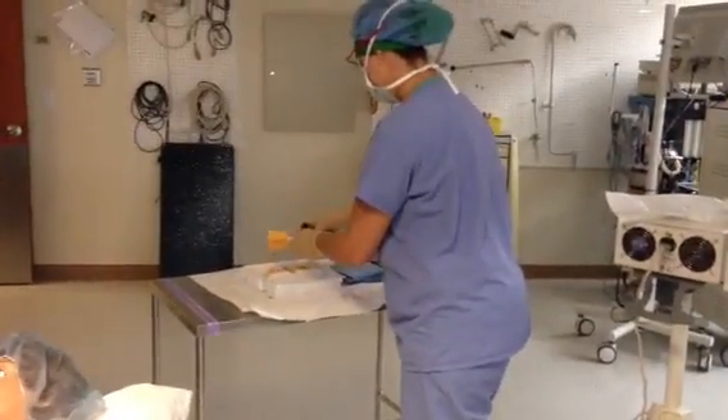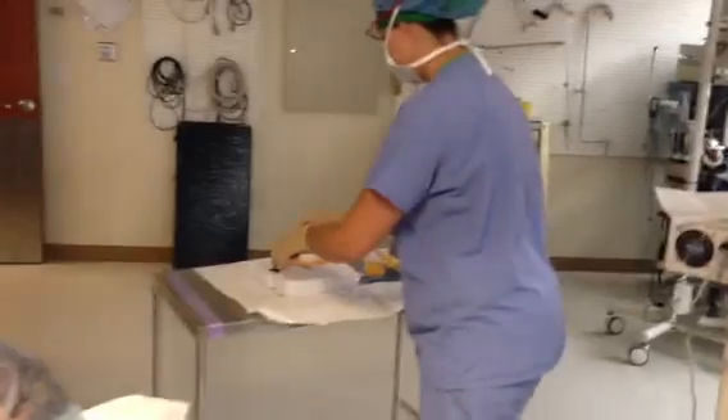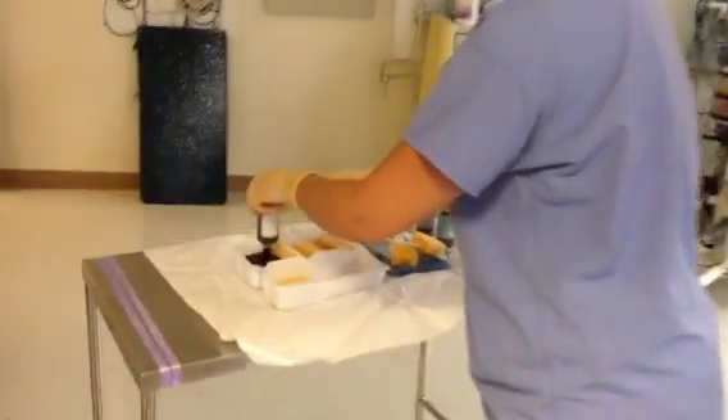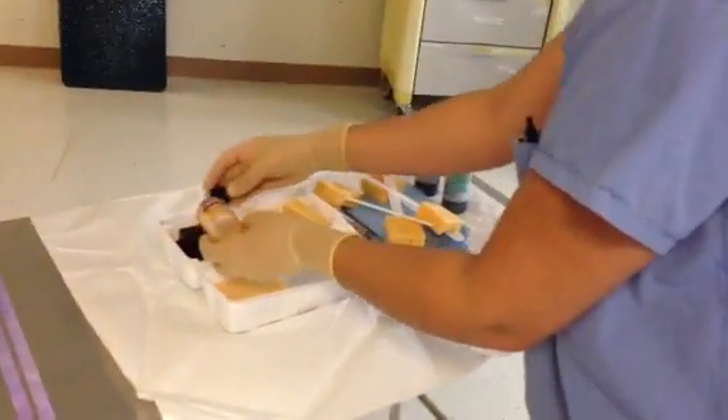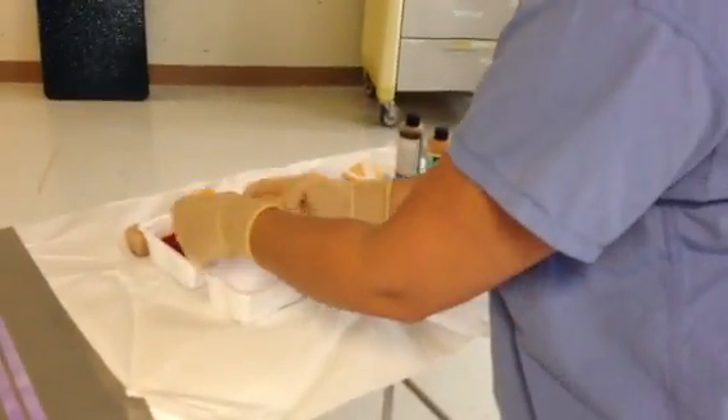Separate your sponges. Make sure that you keep your betadine paint and betadine scrub in separate areas, all while maintaining the sterile field.